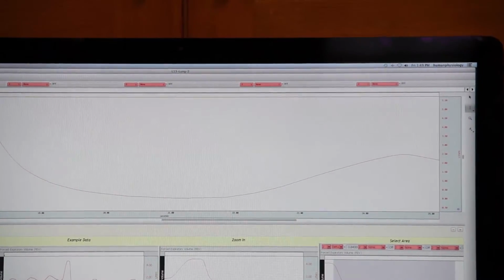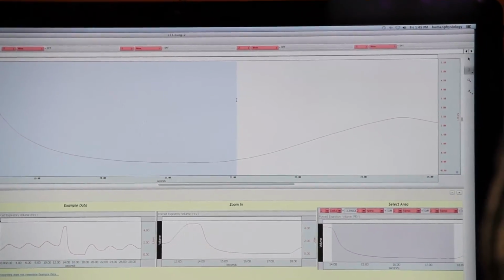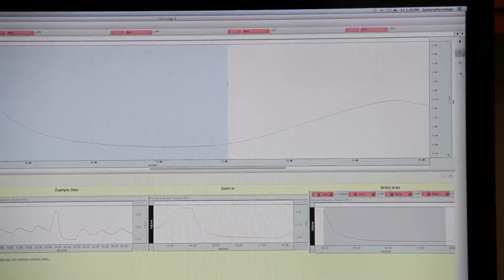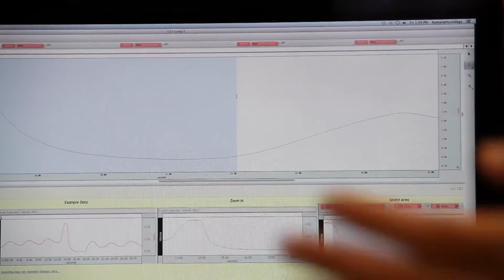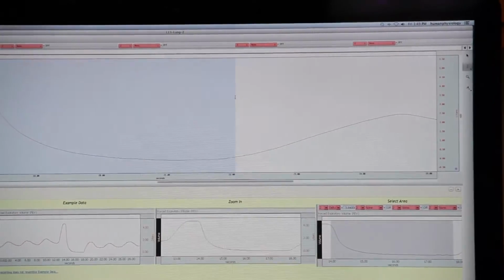Then we're going to measure out at least 3 seconds. Can you point to the delta T box? In the delta T box, the highlighted section should be more than 3. If it's not, then they need to redo their data analysis because they didn't get enough of an exhale. We have to be able to measure 3 seconds out.